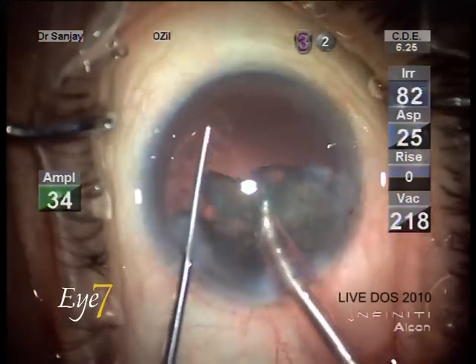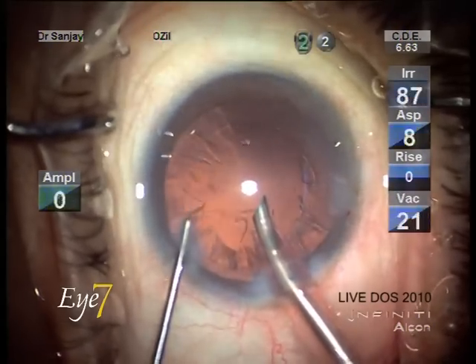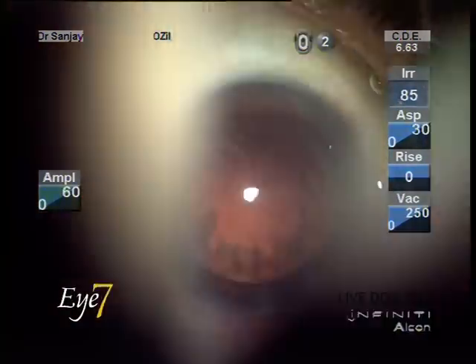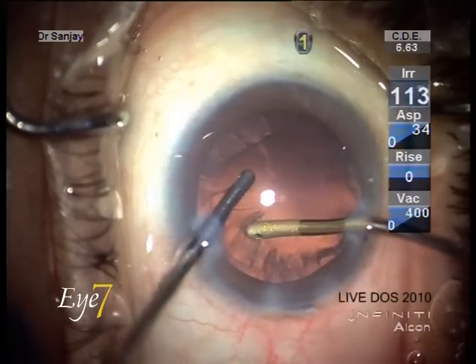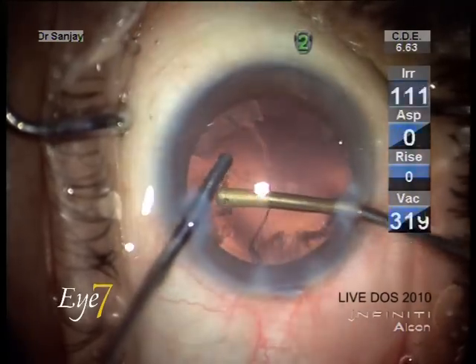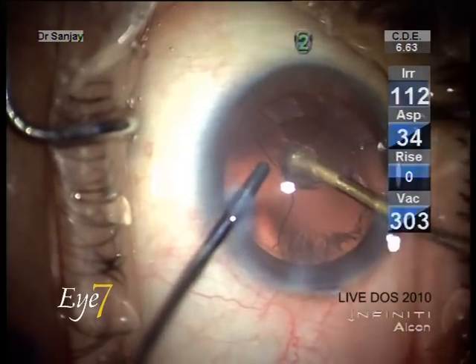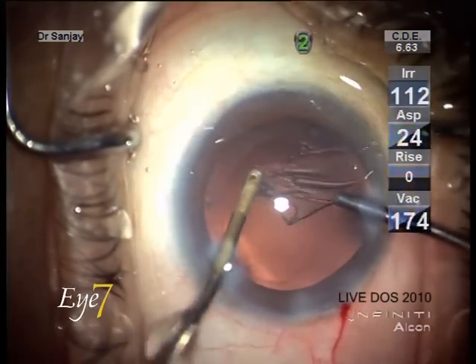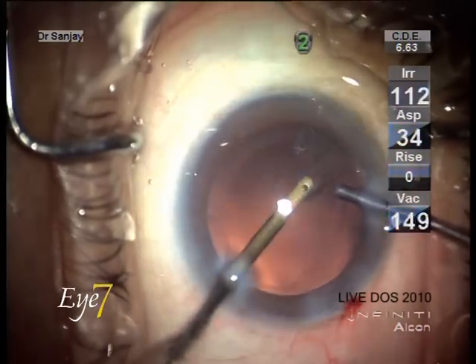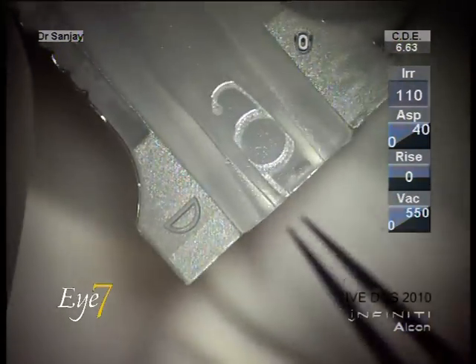We are now removing the epinucleus — the settings have been lowered but the tip stays in the same position and the epinucleus material just flows out. The cortical material is now being removed by a bimanual irrigation aspiration system, brought to us by the Duet company, and the cortical matter has been removed.